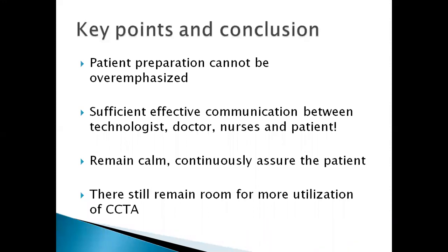It's even better, if it's not an emergency, to say we can't go ahead with the examination at this point and to wait till the patient calms down, than to go ahead and get poorly diagnostic images. So just sufficient communication between you as the technologist, the doctor, the nurses, and the patient as well. And you should continuously assure the patient throughout the examination to make sure that the patient does not panic.